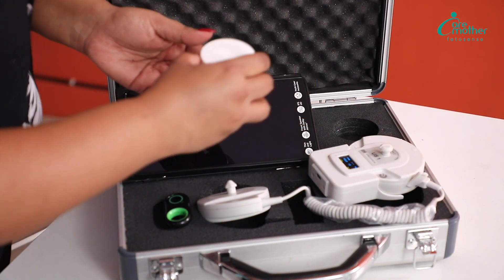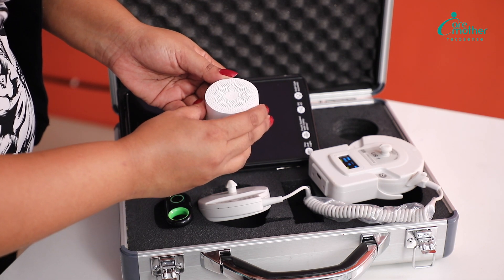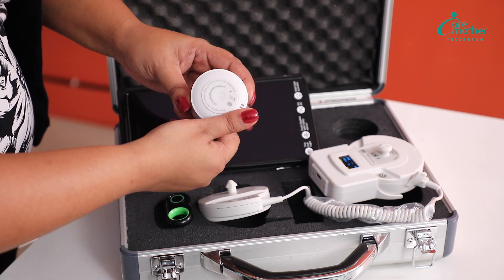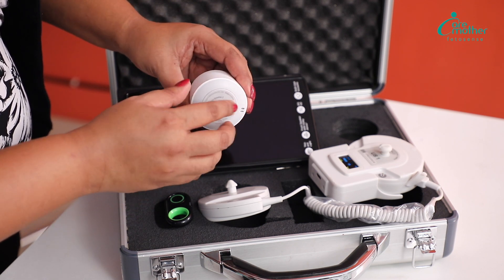Then we have a Bluetooth speaker. This is used to amplify the baby's heartbeat sound. To switch it on, we give a long press at the bottom and the device comes up.